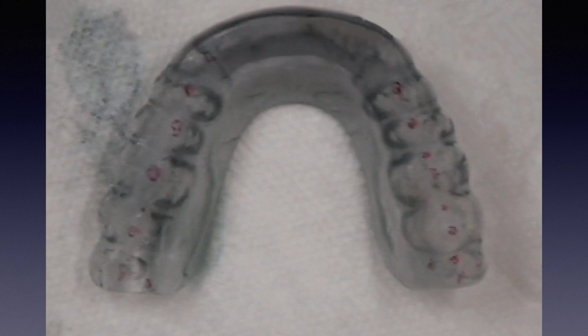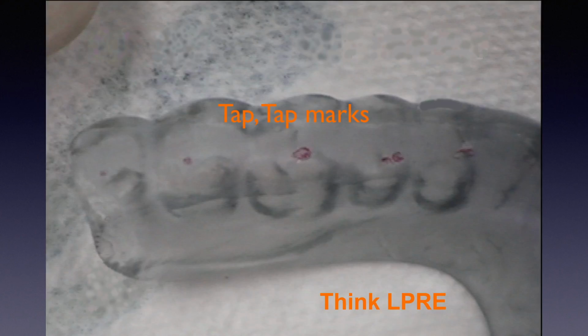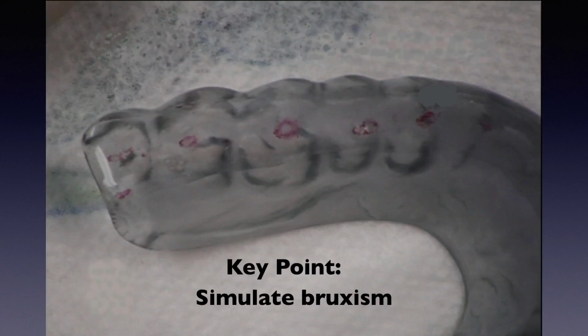These are the first set of marks. What he has done is to ask the patient to simulate her nocturnal bruxism. These are the marks she made before the simulated bruxism. They represent her last postural requirement, her engram. By simulating bruxism, a much greater load is applied and the more distal marks become more apparent. Whether the engram is overwhelmed or not, I don't really know, but it at least is encroached upon.